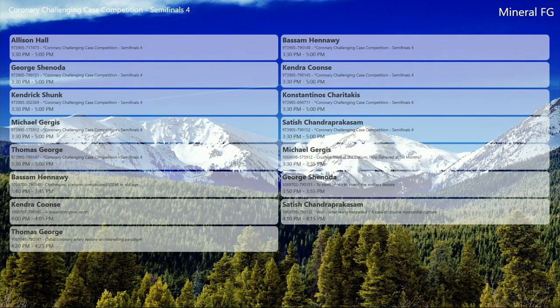The other thing is, from where I'm sitting, it's difficult to see the details of some of the angios. The ostium of the right was a little difficult to appreciate, but you could certainly back your guide out, take a non-selective image, and also use IVUS to confirm that ostial disease. But you mentioned there was damping as well. Yes, damping can occur when the catheter size is bigger than the vessel or it's directly hitting the vessel wall. But we did an IVUS for that also. My IVUS pictures are not running.